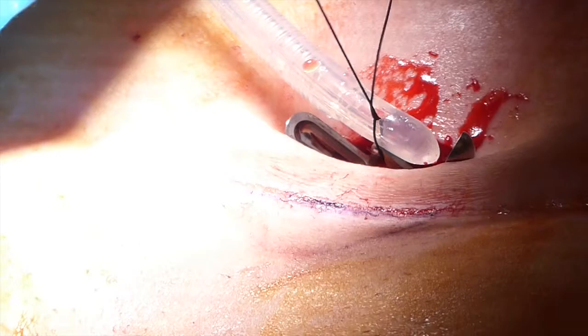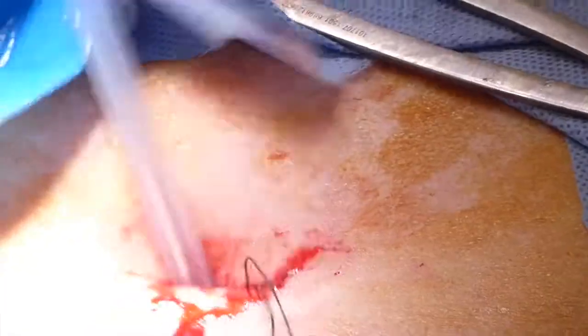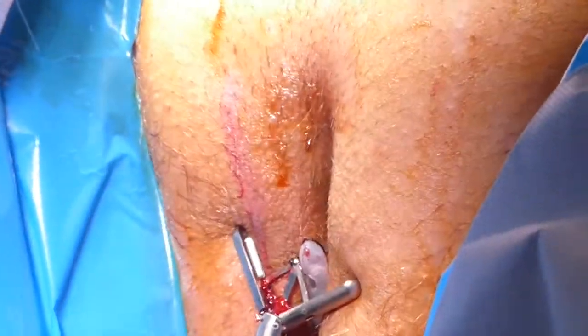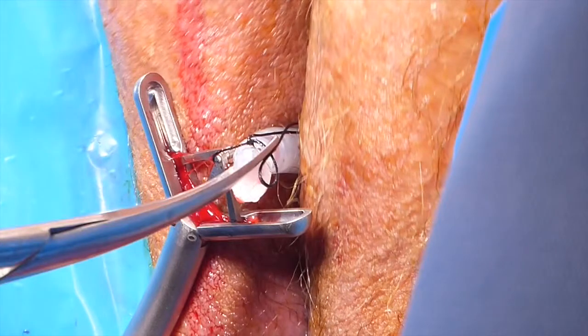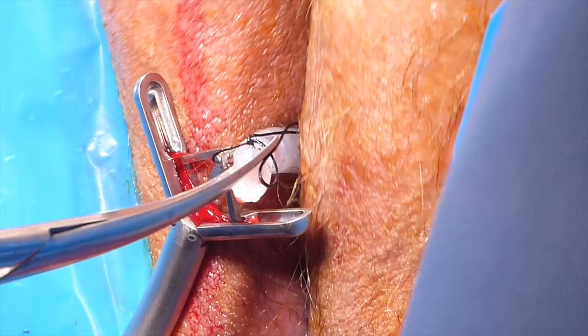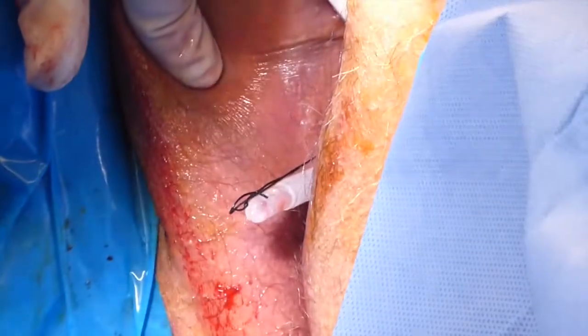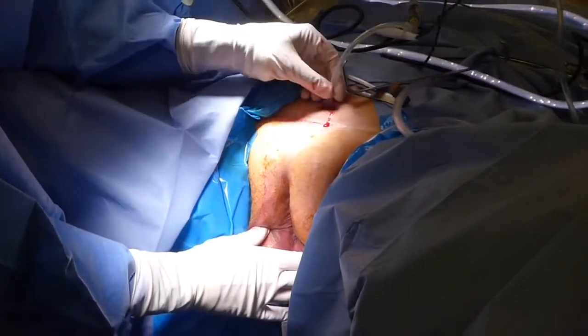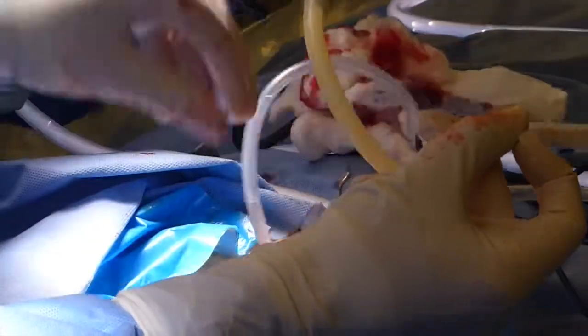Next, align the Foley with the Lousley and secure the Lousley jaws around it. Withdraw the Lousley. Once the Foley tip is visible, cut the suture to release it from the Lousley only — be careful not to cut the suture from the actual Foley. Pull the Foley back into the bladder and inflate the balloon. Verify correct placement with cystoscopy. The suprapubic catheter is ready for use.